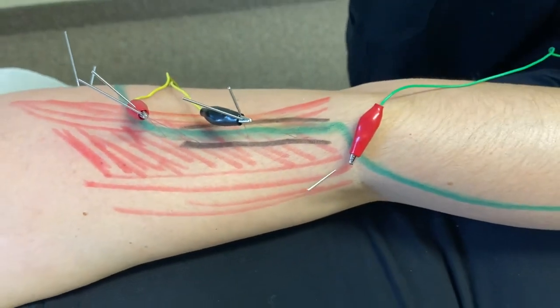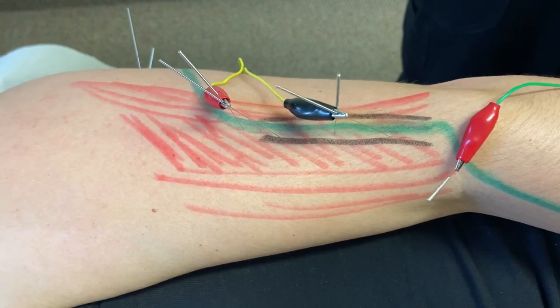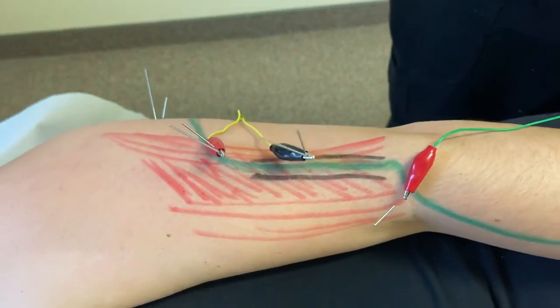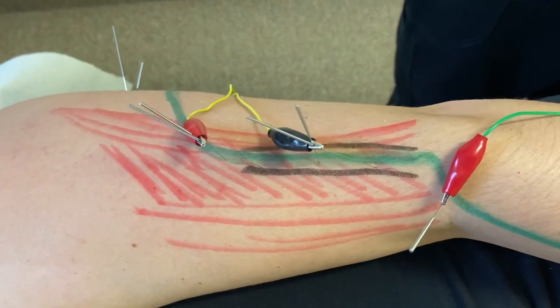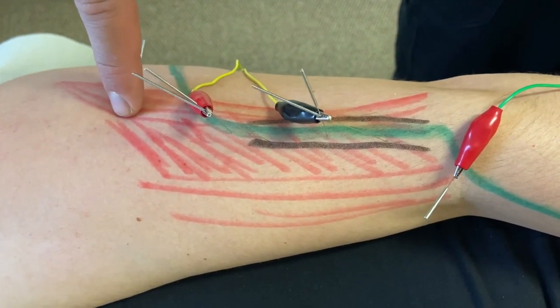And now you're going to feel a little pulse here. And let me see what kind of a contraction. Let me see, get more of a contraction. There we go. Doing okay? Mm-hmm. So just back pan just to kind of give everyone a picture of what we're seeing, and we'll come back in. Great. We're covering this segment, an inline technique, on this segment of the radial nerve.